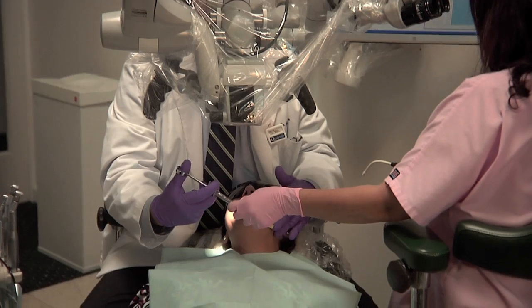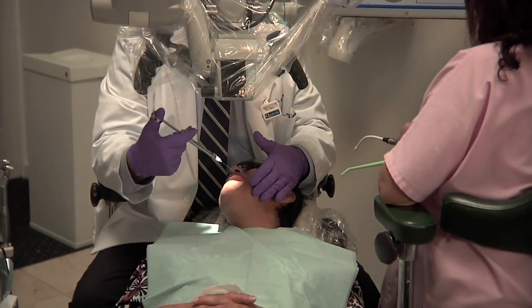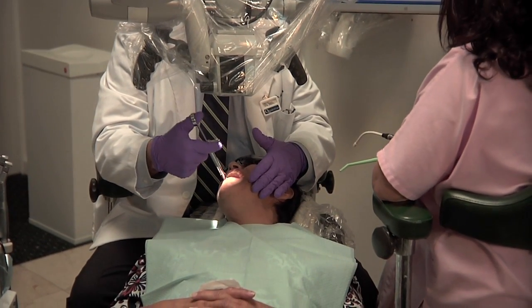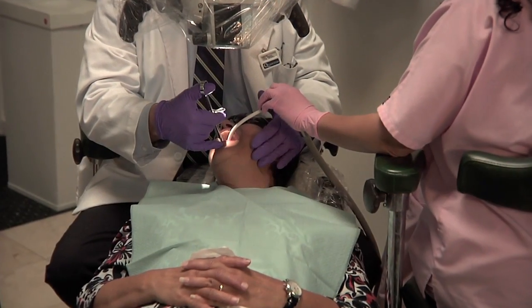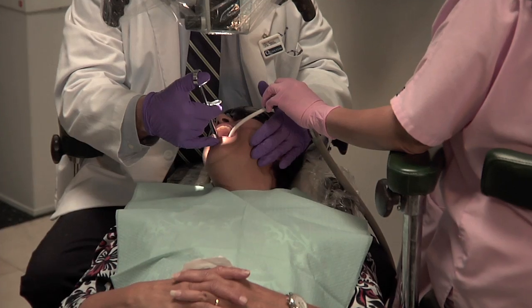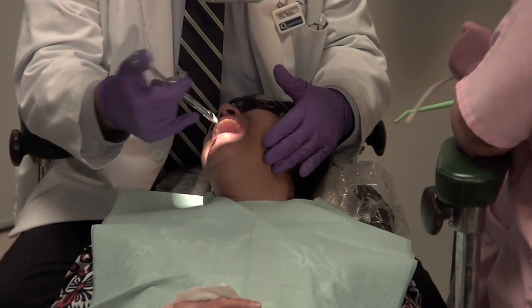This is a right mandibular injection. Notice how I turn the patient, turn the chair, and you have complete visibility while doing this.